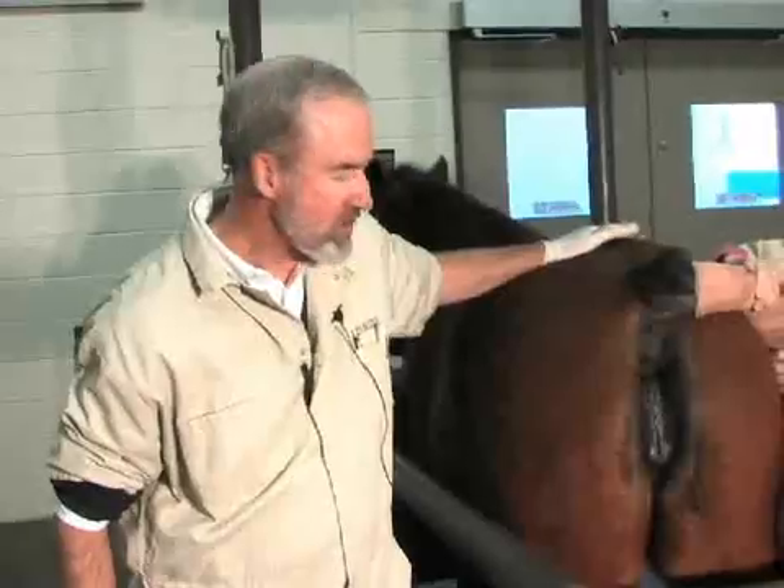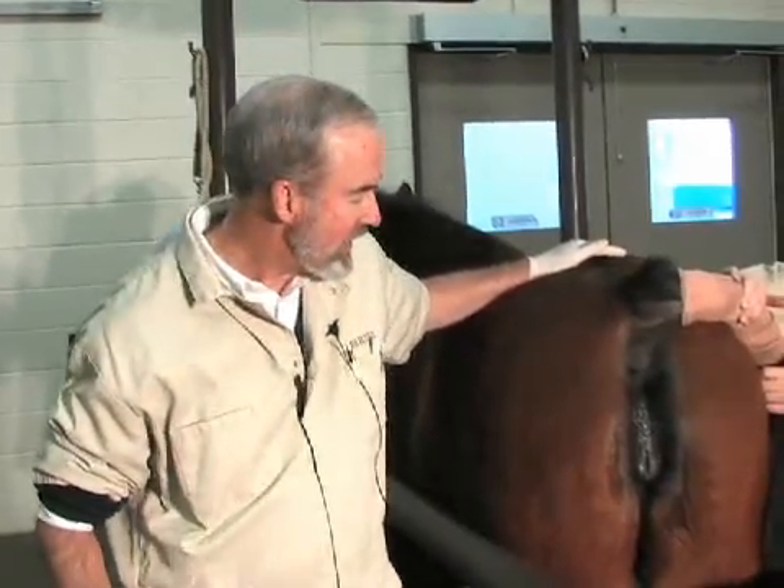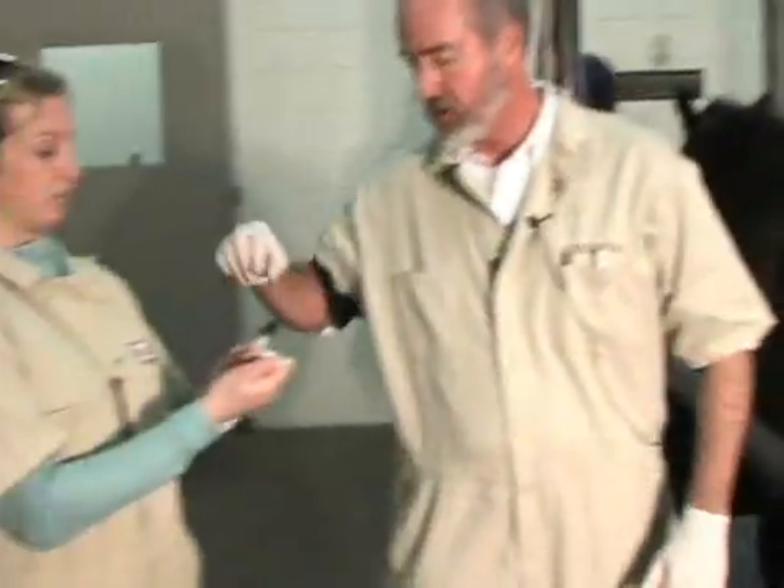We're going to turn it over to Dr. Riddle now. Thank you for joining us. Thanks, Erin. We're going to demonstrate the procedure for obtaining the clitoral fossa and clitoral sinus cultures. These cultures are necessary to be taken in mares that have been imported, and also mares that may have been exposed to CEM, to determine if they have been infected. What we're going to do first is the clitoral fossa culture.